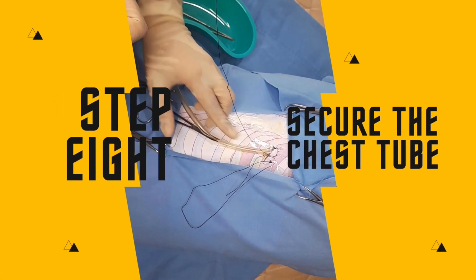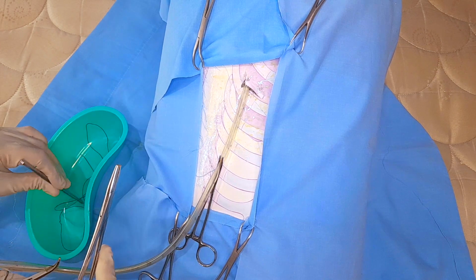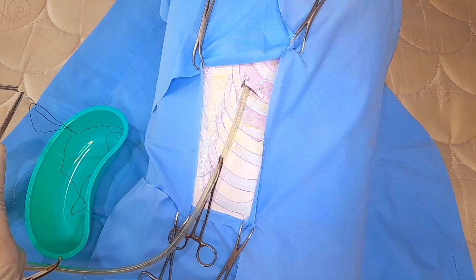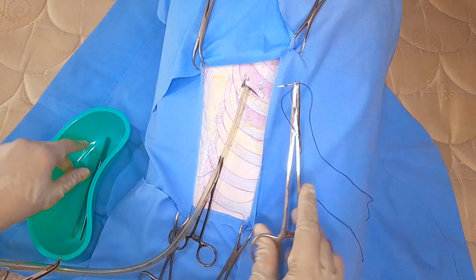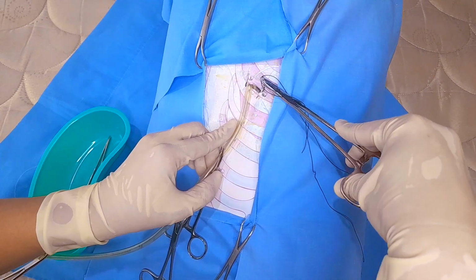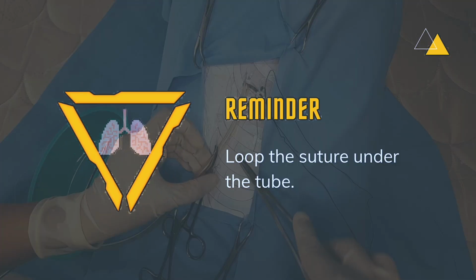Step 8. Secure the chest tube. Suture the tube into the skin starting at the side of the tube. Use silk zero suture. Reminder: loop the suture under the tube.